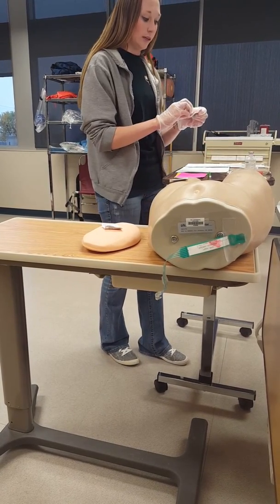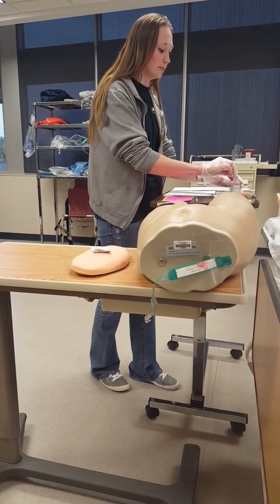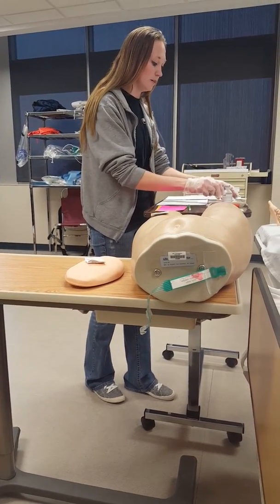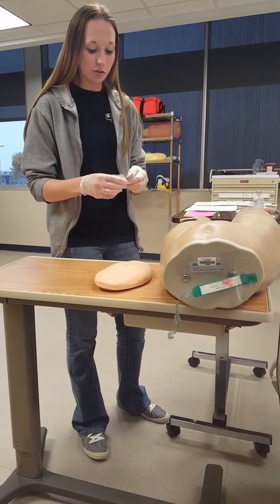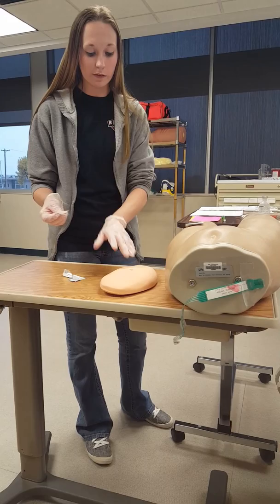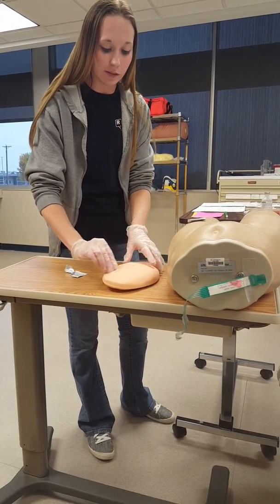So now I'm going to clean my vial. And I would do this for 30 seconds, again, for the sake of the video. And then I'm going to clean the spot that I would be giving it to you on your stomach. And you're going to have it 2 inches away from the belly button. So I clean that area.